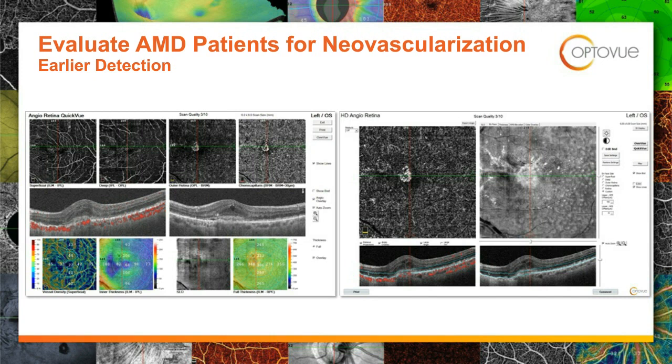Now, of the 2 images below, the image on the left is showing the blood flow activity. If you look at that middle B scan, you can see all the red on the left side there, that's the choriocapillaris. We expect blood flow to be there. Then you see it disappear, and then you see it raise up into that hyperreflective cavity there. When you see hyperreflective, that's a really strong indicator that that could be a choroidal neovascular membrane. And right below it, you can see the blood activity. That's an active choroidal neovascular membrane.